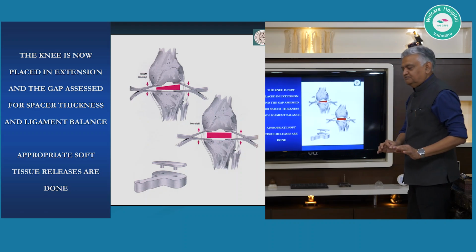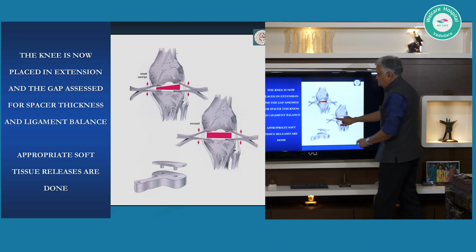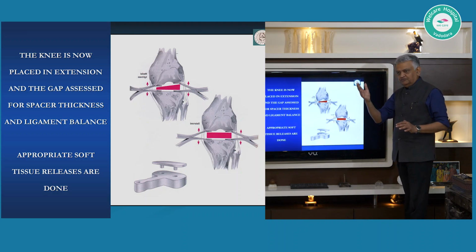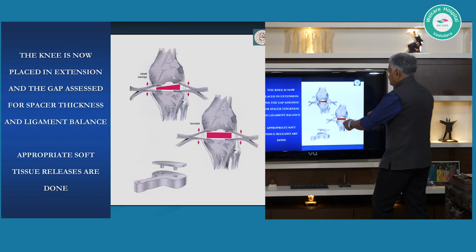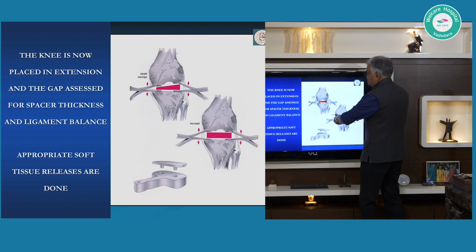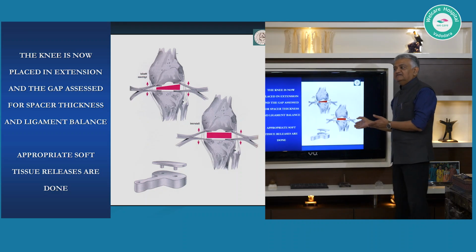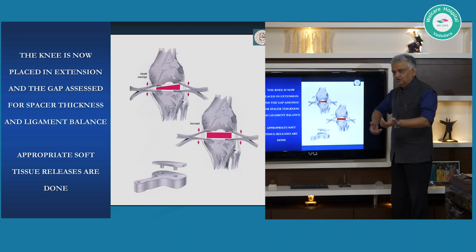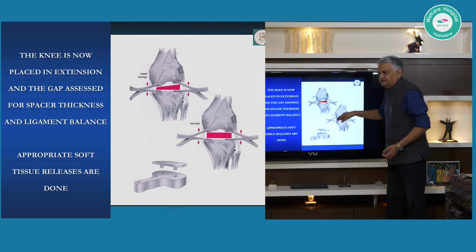बाकी जो underlying principle है extension में rectangular gap, which basically stretches out the ligament and brings adequate tension. Now what is adequate can be another area of discussion. कि what you see on the table, even if you have sensors put into soft tissue, some sensors which can generate a tension figure to it, you know, but that is in an anesthetized patient, and the tension you are generating is either by virtue of your muscle power or by the tension you generate by stuffing it with hard metallic object.